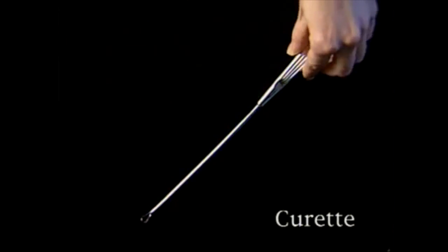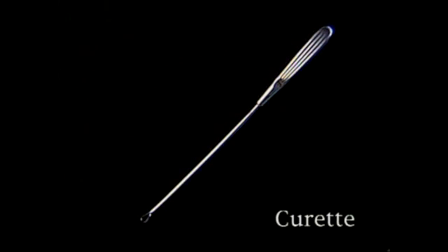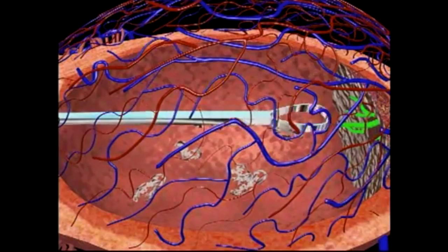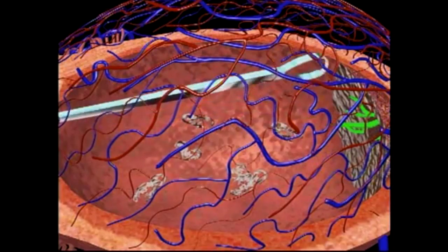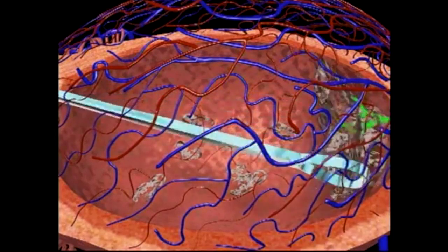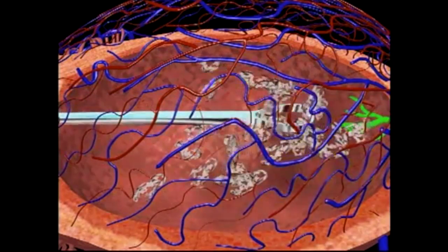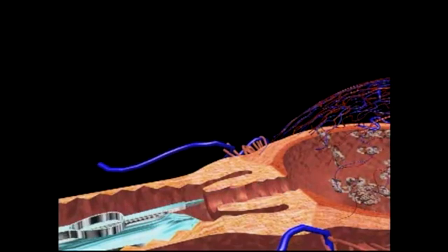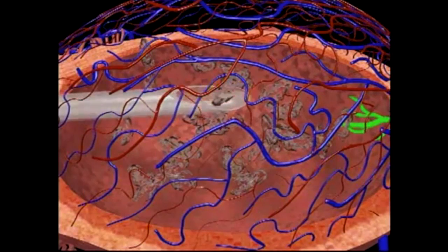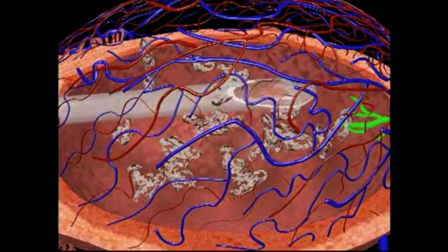Once that's completed, a metal rod with a loop on the end, called a curette, is scraped along the inside wall of the uterus to dislodge any remaining tissue or placental matter. After that, the suction cannula is again inserted into the uterus in order to remove the tissue that was dislodged by the curette.